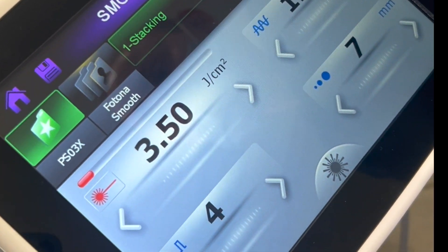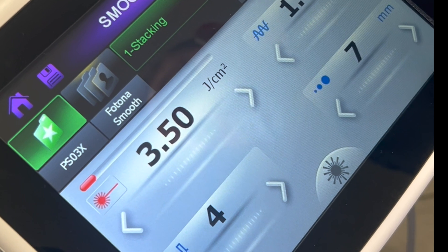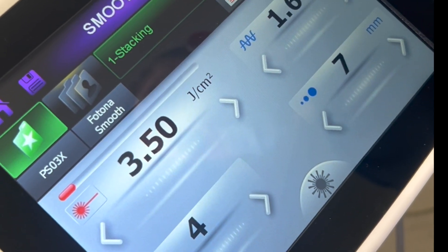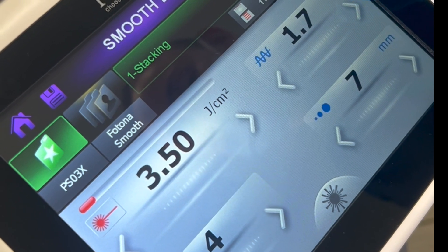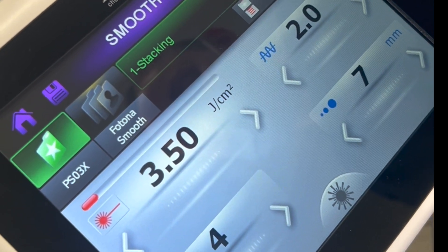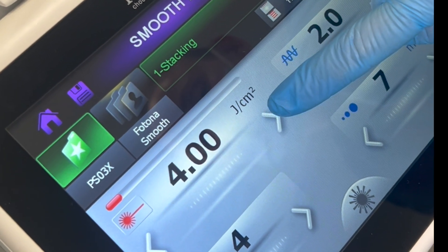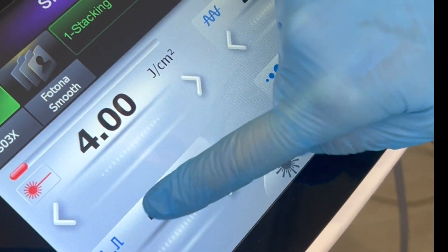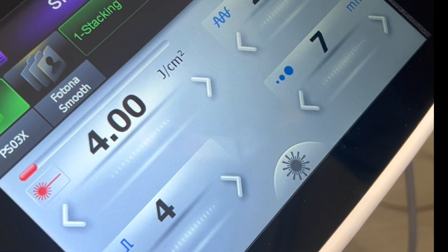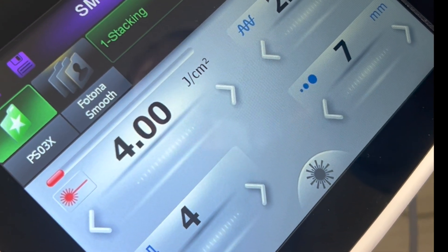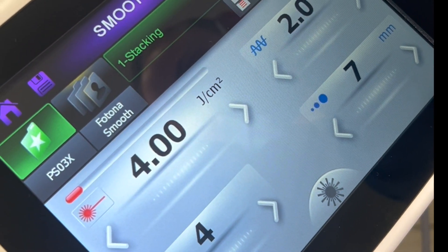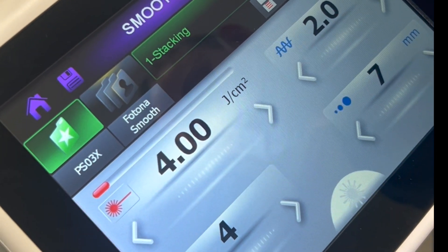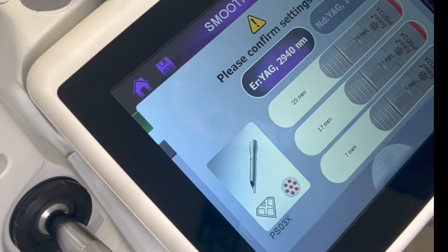This is where you can input your settings. These are the presets set by the device, so you can adjust your speed, your energy setting, and ensure that your pulse width and your spot size is as you need it. When you're happy with that, press and hold down the sun, and that means the laser is now live and ready to go.